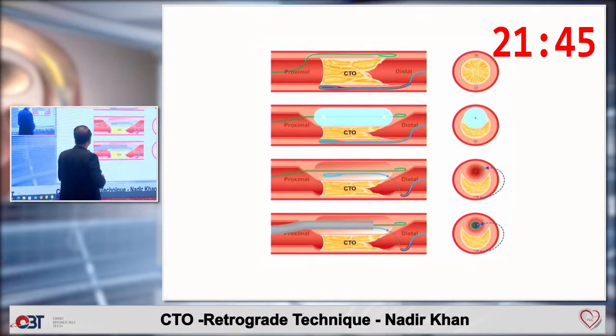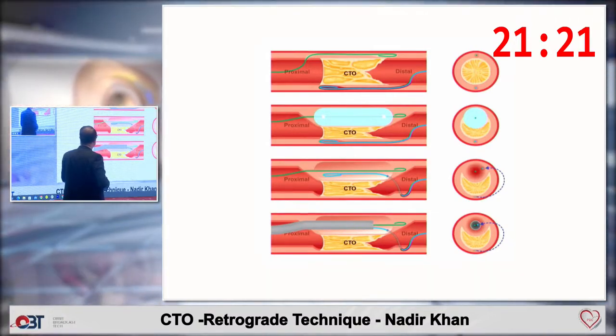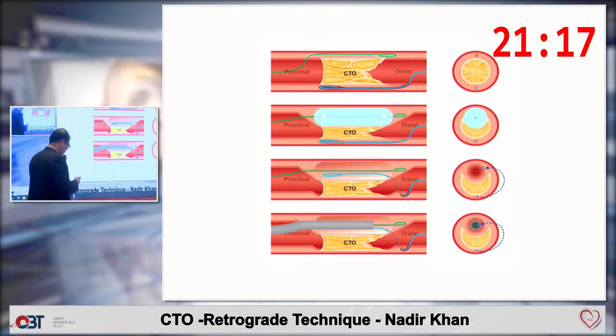This is the same shown in a cross section. This is the lumen, both the wires are subintimal, and then you inflate a balloon and redirect both wires in the subintimal space. And you note that only the segment of CTO is involved in this subintimal tracking. So you try to minimize the area that your wires go subintimal.